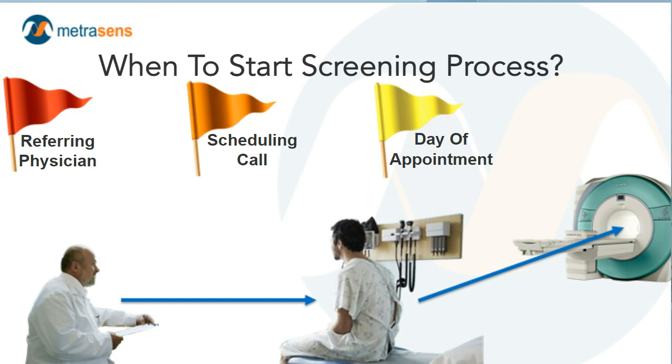So leverage the referring physician and their closer knowledge of the patient's medical history, medical record, to identify potential concerns or conflicts, leveraging that existing body of knowledge. And again, we're not interested in having the referring physician fill out an entire screening form, but having them understand that they have a role to play in the clearance of this patient and getting them to facilitate that clearance. That will make everybody's lives a lot smoother and easier.